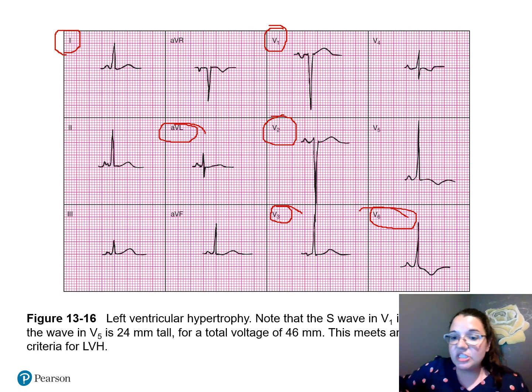Now, when you get used to looking at these EKGs, you know what's normal. And you know our QRSs should not be going off the chart, right? Look how close V2 and V3 are. Look at V6, how much off the chart it's almost gone. Obviously, these are all bigger than 2 boxes except for these 2 right here.